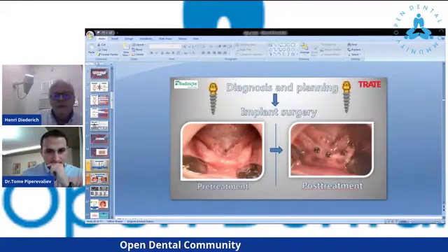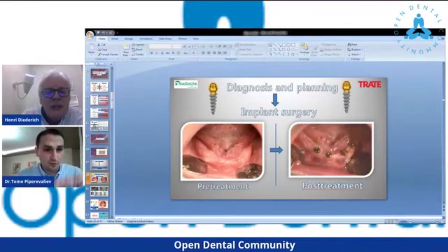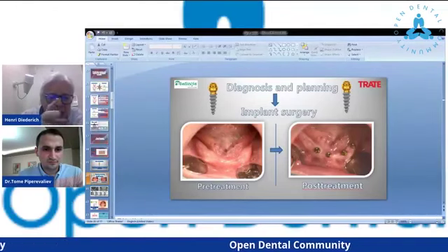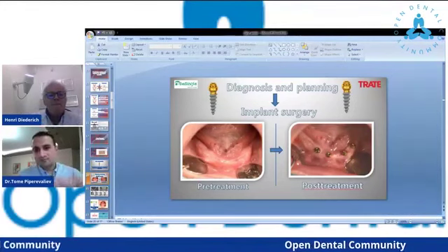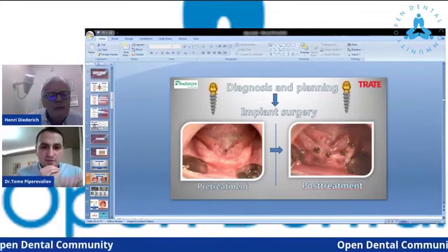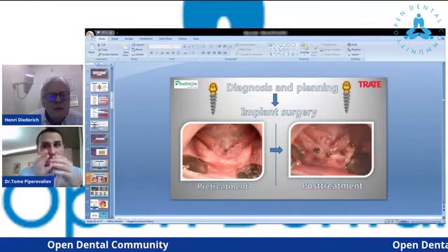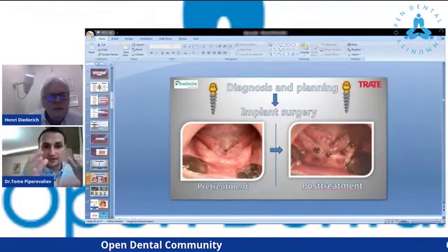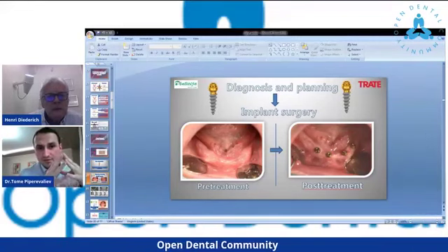Yes. So I think these implants are quite unique. It may be interesting if you explain a little bit how you feel about this type of implants. They are very good implants, because with compressive implants we can achieve a good torque, and the advantage of this implant is the multi-unit platform that gives us the possibility of producing screw-retained constructions.